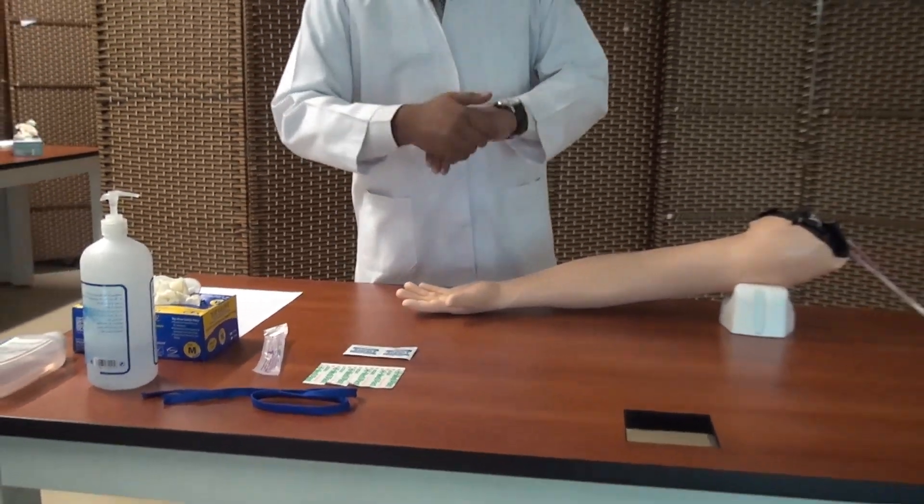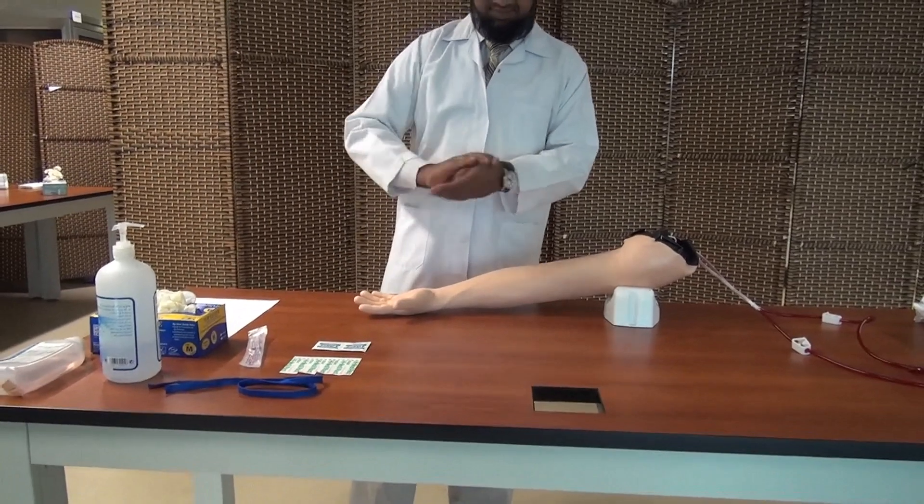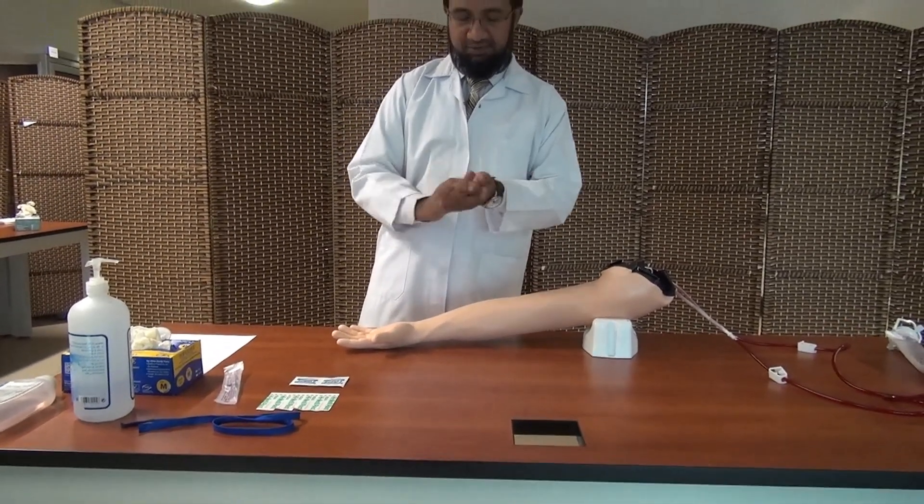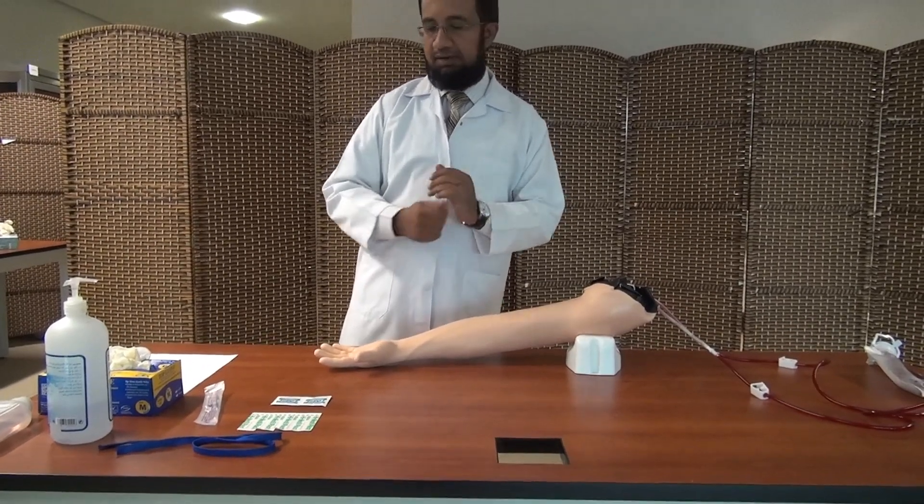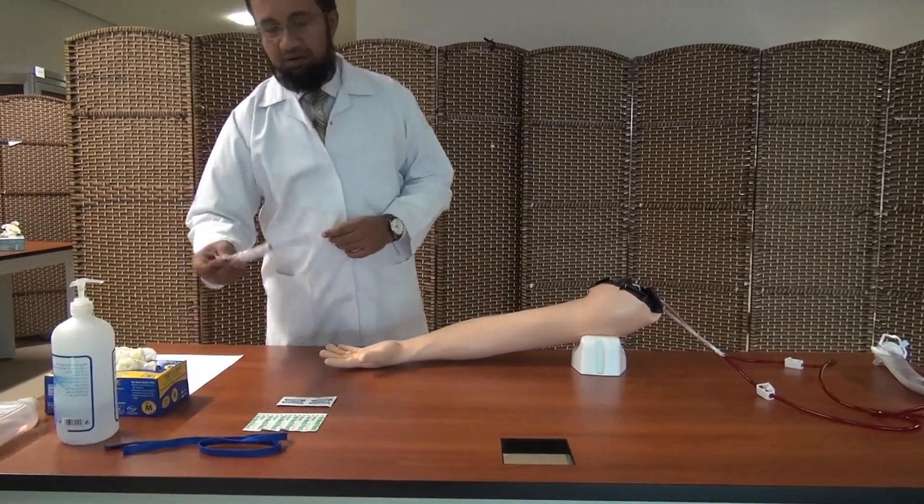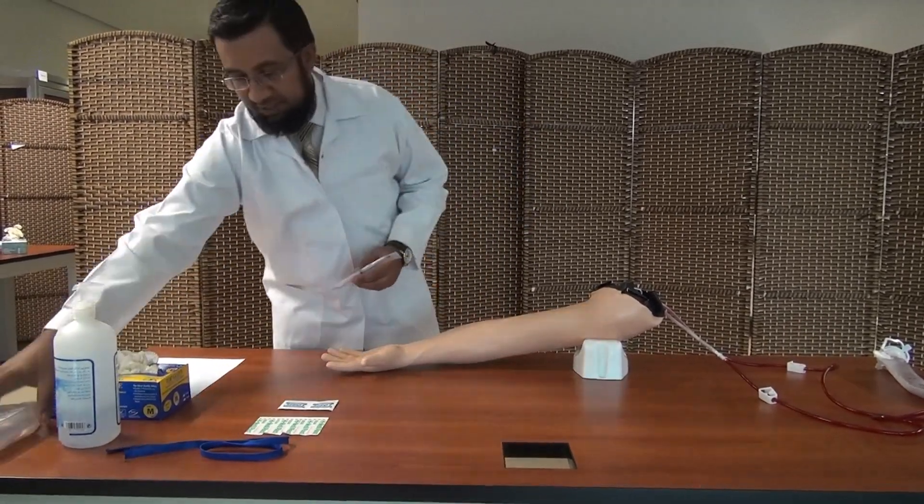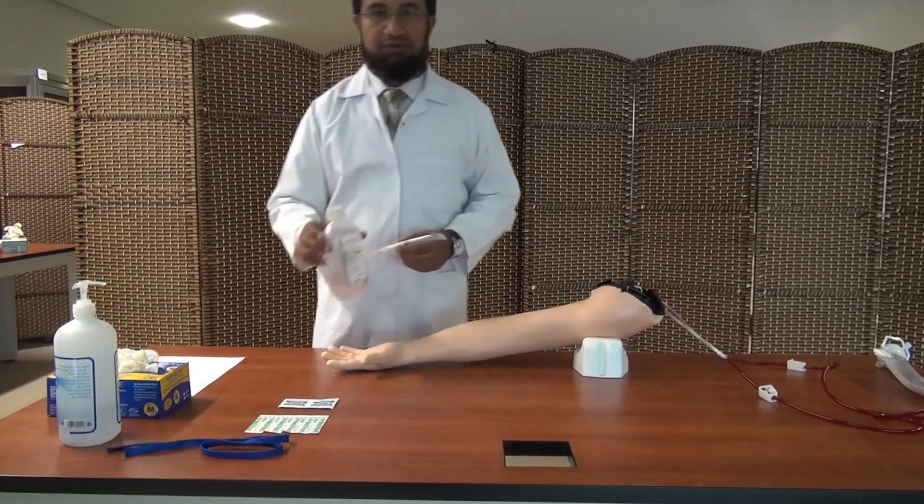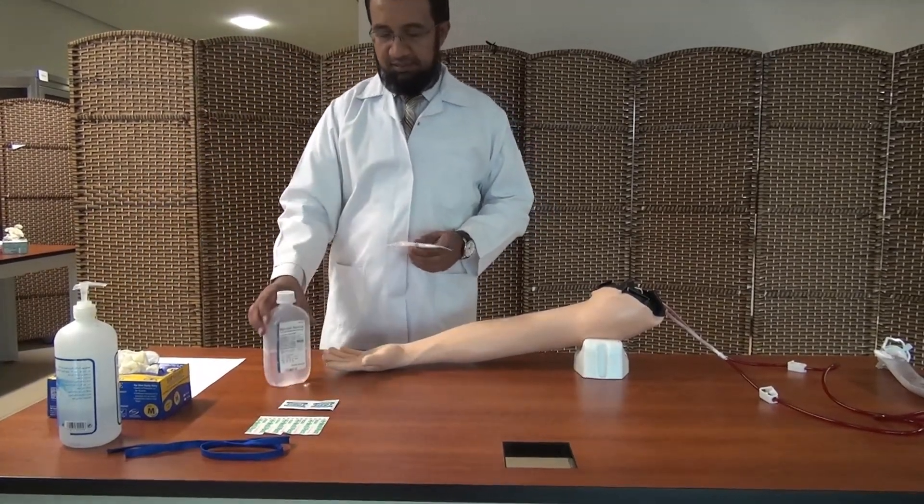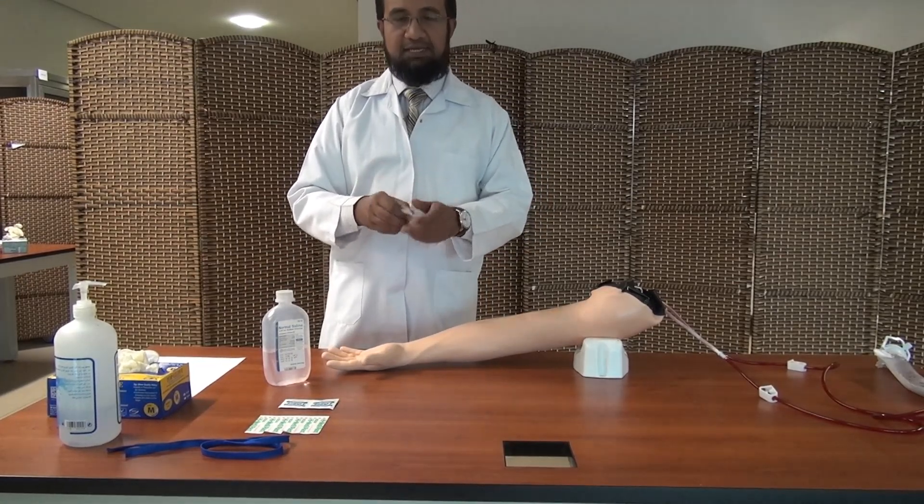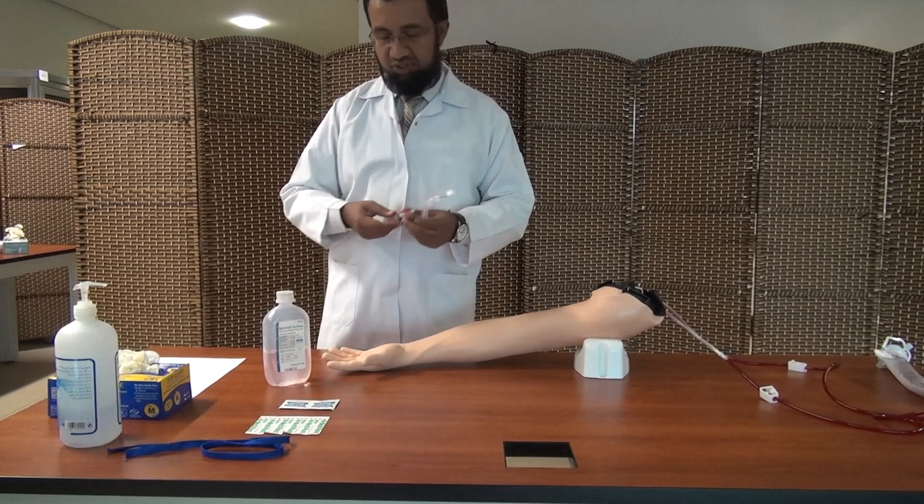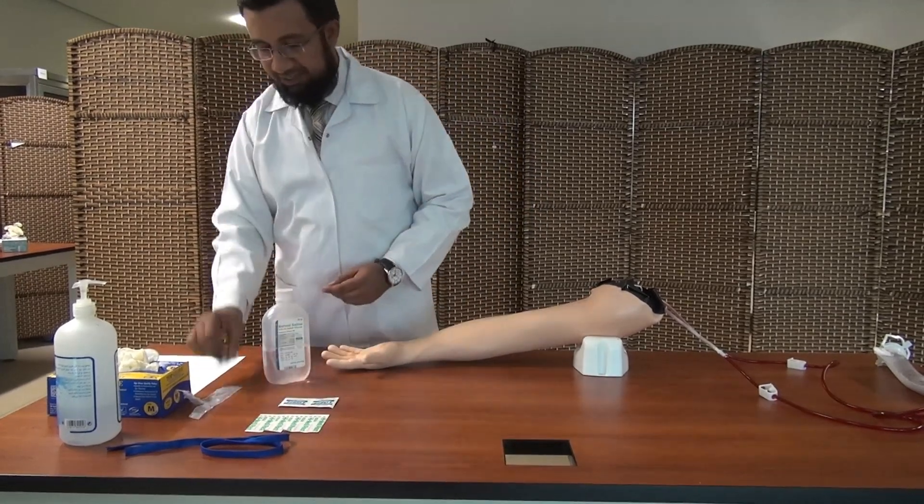So let's start. For this procedure, I will use the intravenous injection mannequin. Now for the purpose of demonstration, we will use normal saline to draw one cc of normal saline into this disposable syringe and then apply later on.